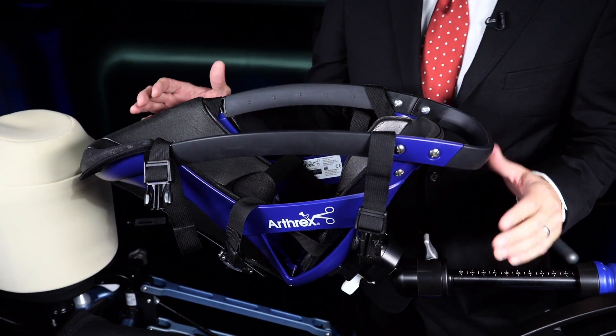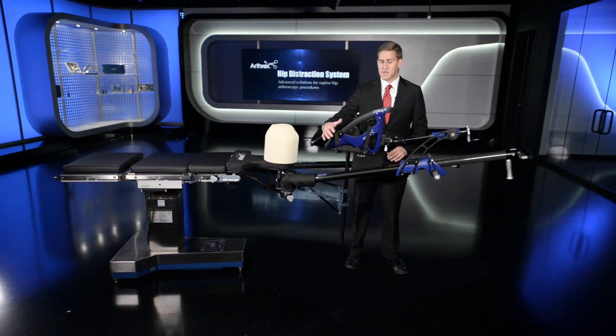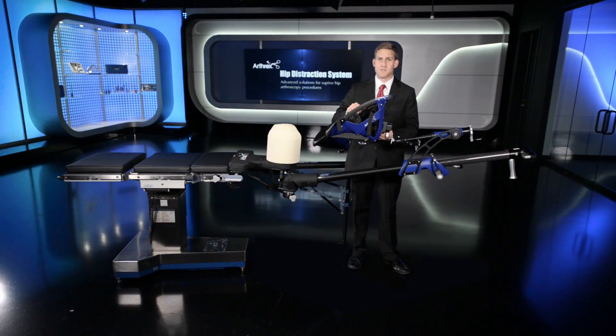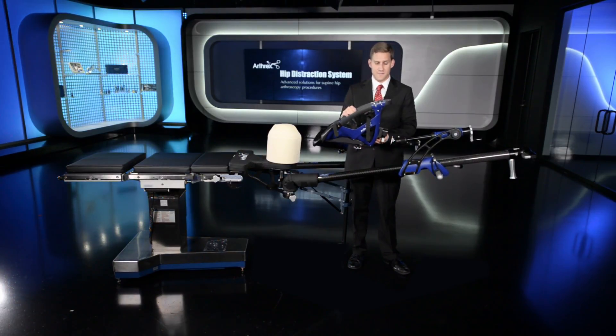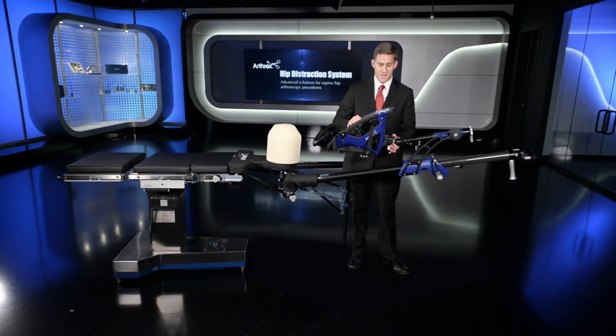The boot itself has a four strap system with pads on each of those straps. There's an outer shell construct with large handles and you can detach the boot during the procedure to do your range of motion check. You simply lock the boot back to the Teletrack carriage via this metal key and white tab on the bottom.